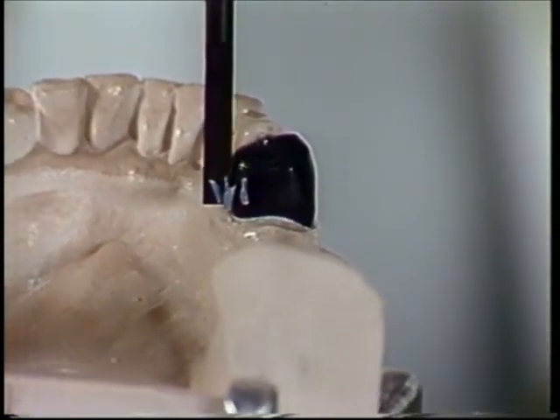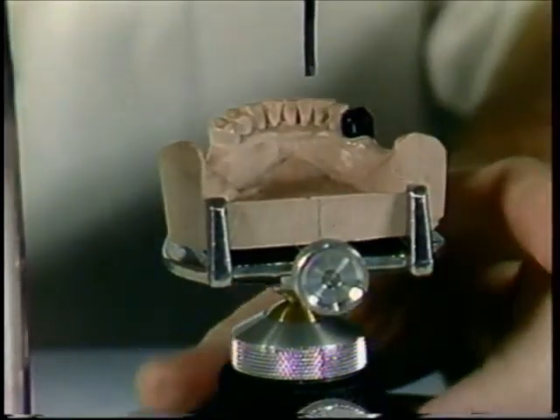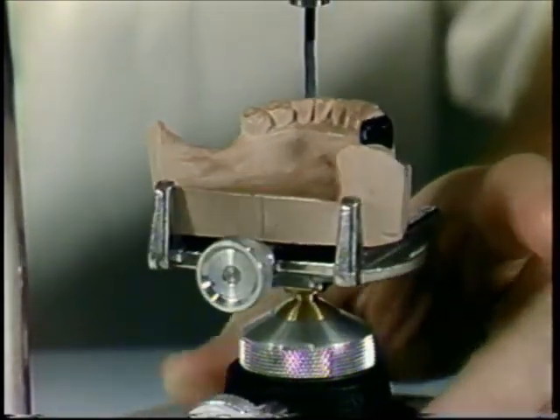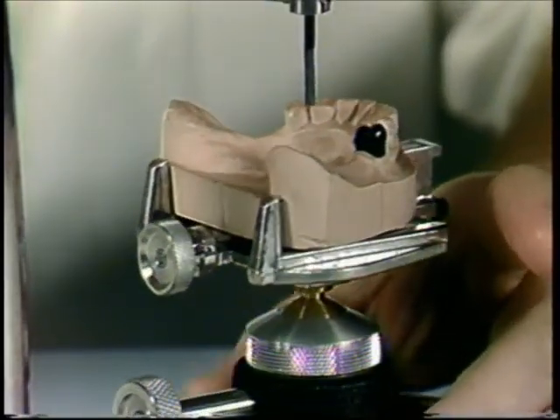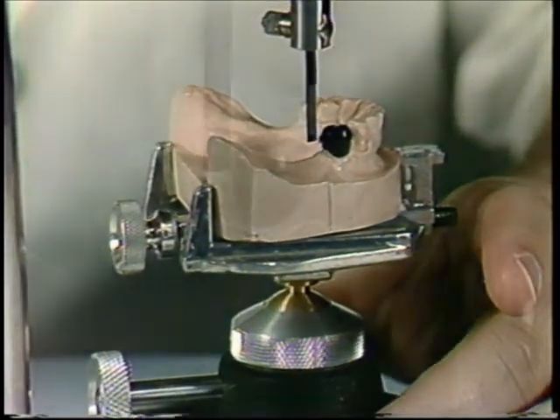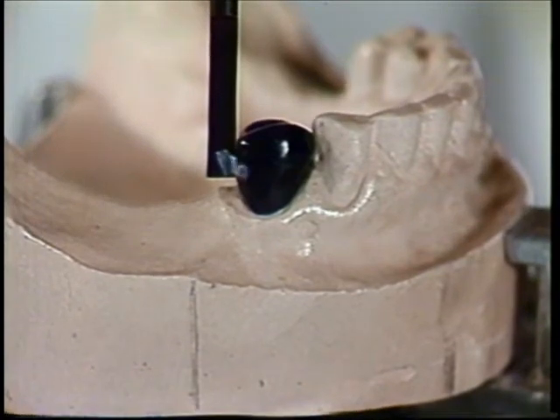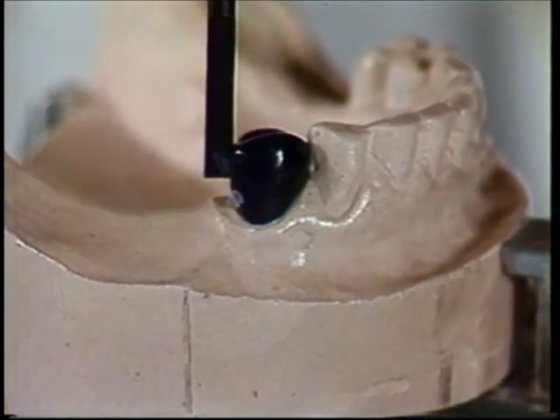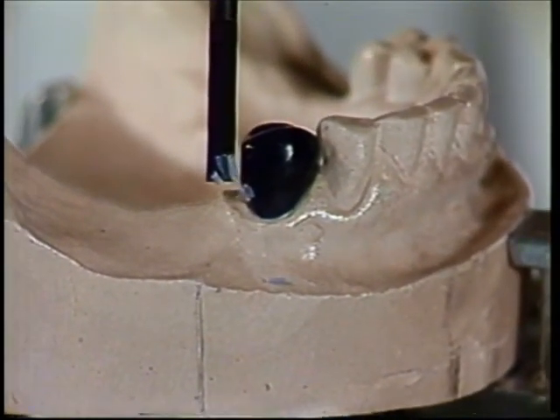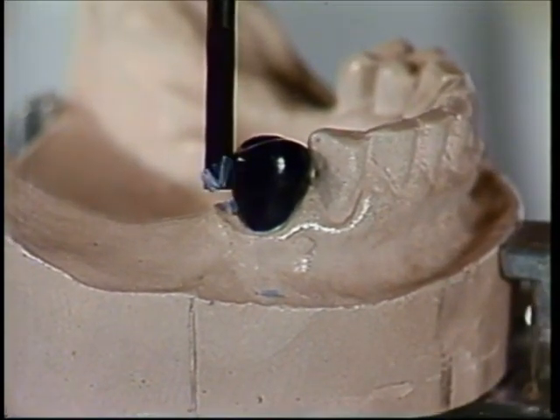The carving tool is being used to contour the wax pattern for a surveyed crown. The carving tool may also be used to place guiding planes as well as lingual contouring. Other simulations may be performed on the stone cast. If it can be done on the cast, then it can be done in the mouth.